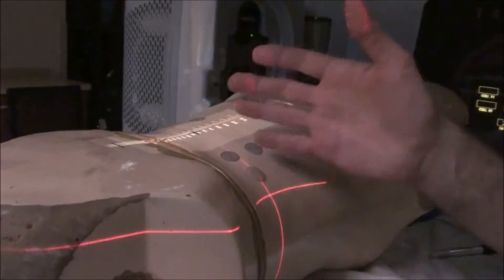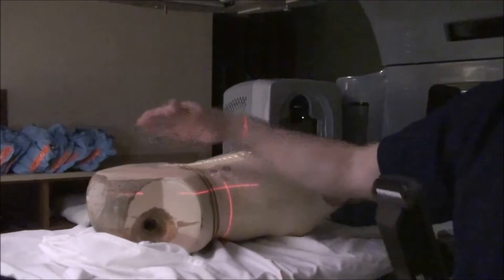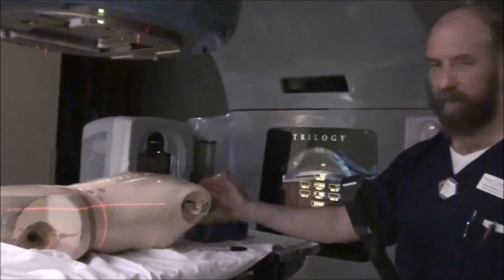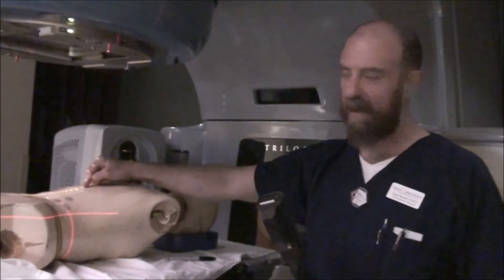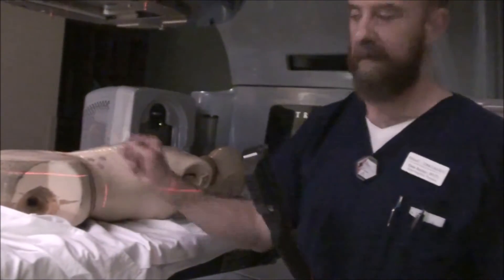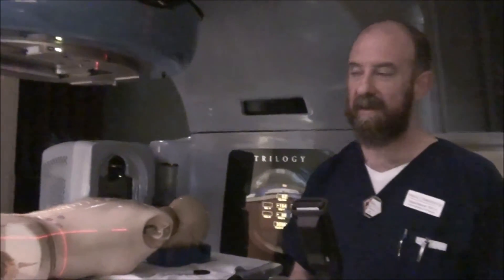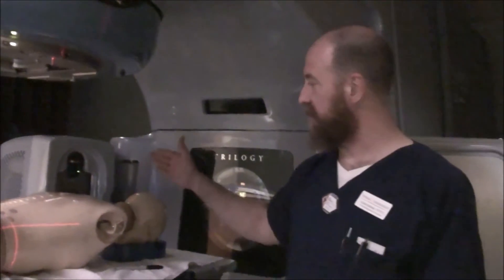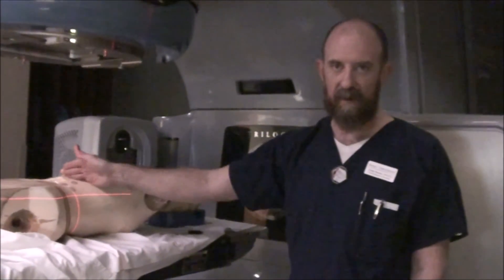Now we've treated a cranial spinal axis. Start at the head — every match that you make determines where you set your next field. You're going to have your cranium set, then a match line, then set up your superior posterior border and match to that. Create your next match line, move in and out, set your inferior posterior border, set your next match line, and execute your gap. It's not as complicated as simulating, but no simulation is simpler than a treatment. Remember, you've got multiple match lines to deal with so that each of those divergent fields is matched.